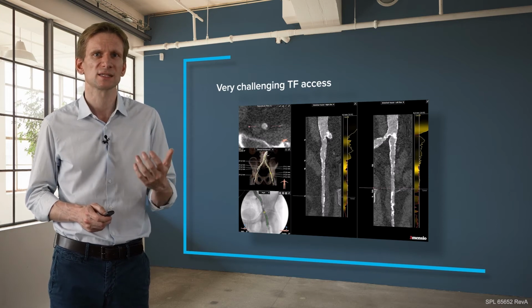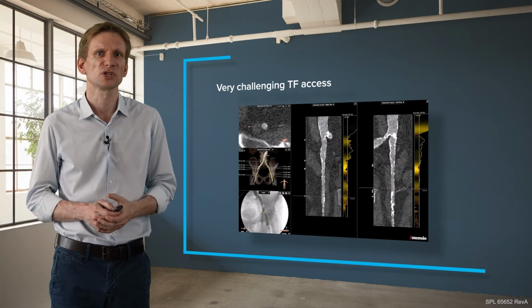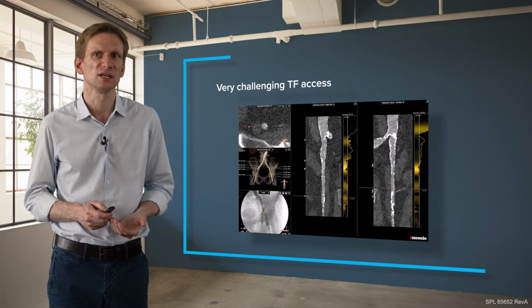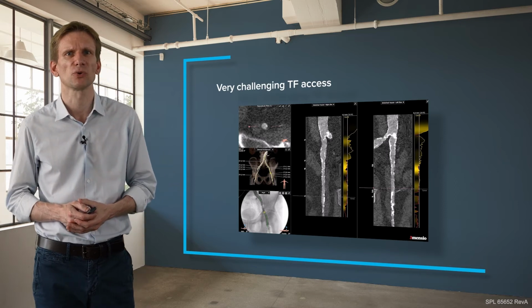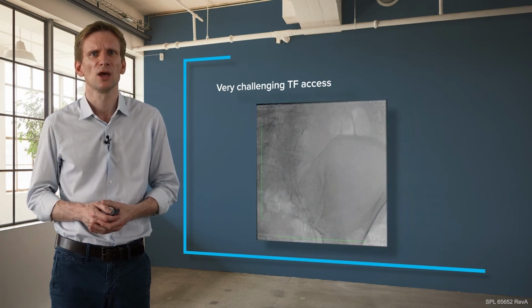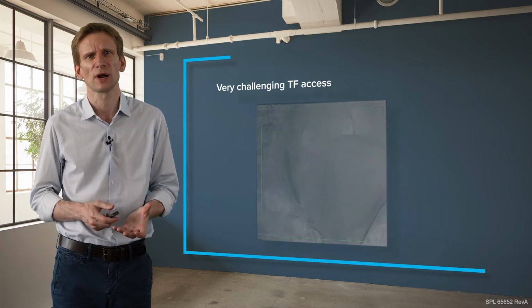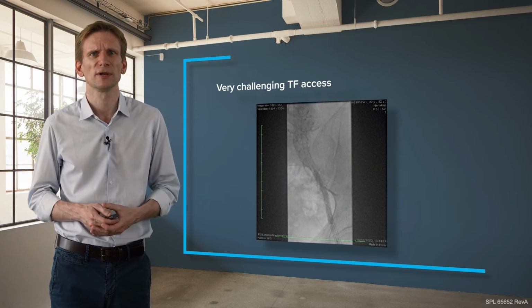But okay, with the necessary caution and measurements and having a safety wire across this lesion, I will definitely proceed with this case transfemorally. So that's also what I want to show you here. Keep in mind the most severe calcifications were at the common iliac here. So again, we expand our shockwave balloon here, the 7 mm balloon. We expand to 4 atmospheres. We give the pulses. We treat this whole trajectory.